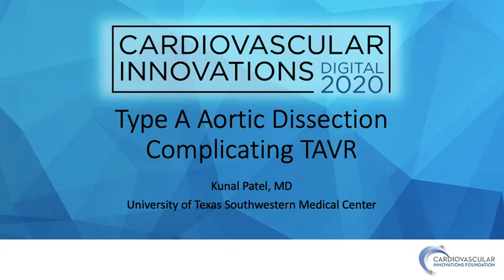Hi, this is Kunal Patel from the University of Texas Southwestern Medical Center, and I'm going to present a case of a type A aortic dissection complicating TAVR.